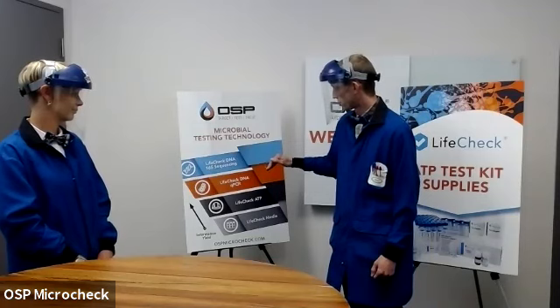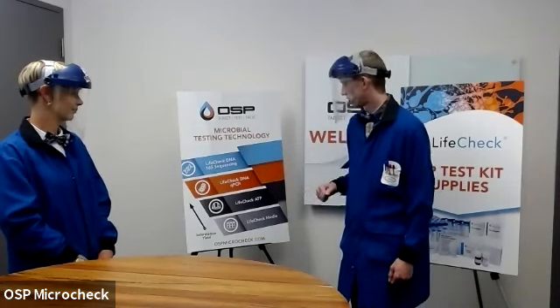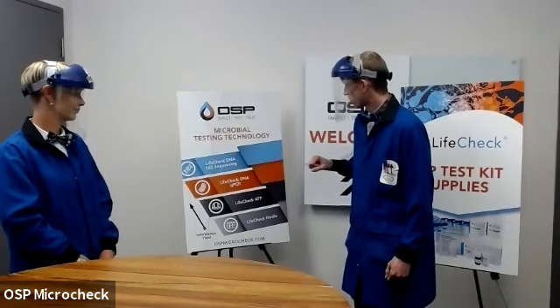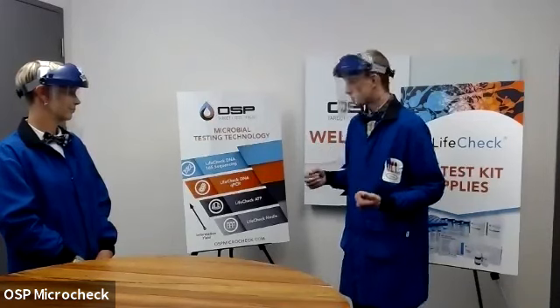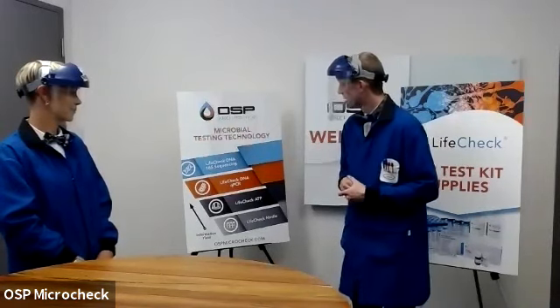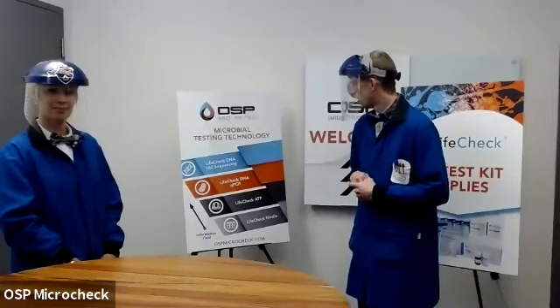Moving on up that information yield scale, we find our ATP testing technology, again, the focus of what we have to discuss today. The important thing to note about ATP testing is that because it is a biomolecule found in all living cells, the resolution it's going to capture is going to be far greater than the culture media. However, it doesn't tell you what type of organism is present. So you're going to get a microbial number of an active microbial load, as in a living representation of the microbes in your sample, but it's not going to tell you who they are and what they're capable of doing.